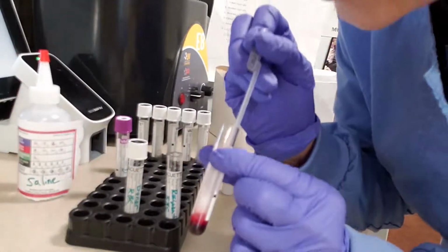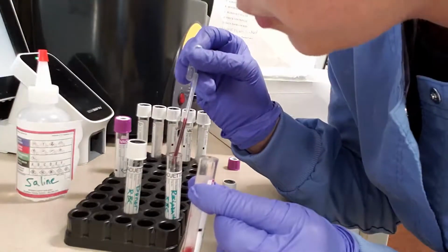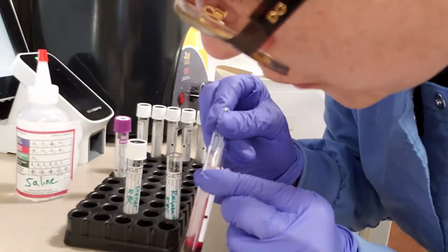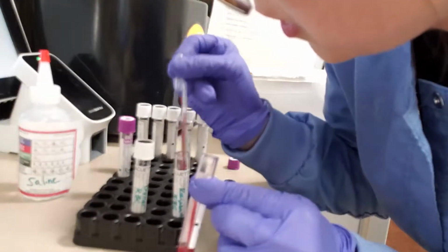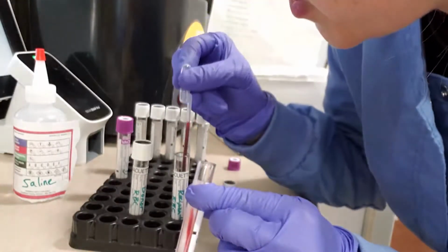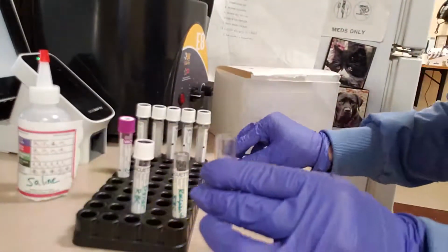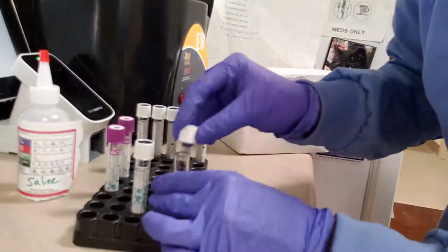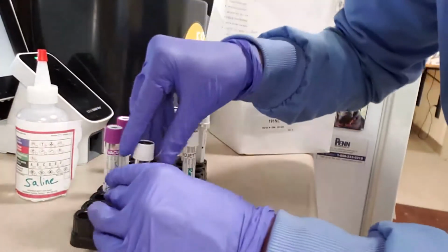and when we wash our red blood cells, we want to make sure that we're getting 1 drop of red blood cell to about 20 drops of saline, or we want to fill the tube at least 3/4 of the way full. That way you can be pretty sure that for each drop of red blood cell there's enough saline. So discard that. Okay, so we have our recipient red blood cells we're ready for.